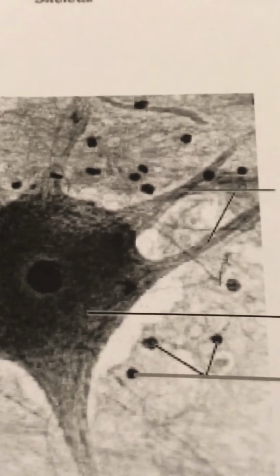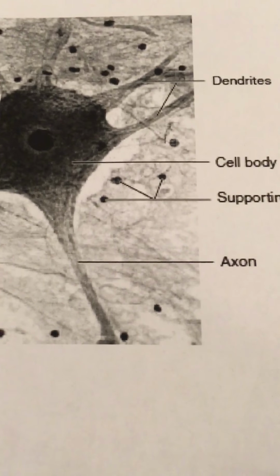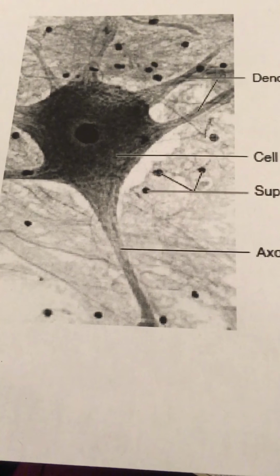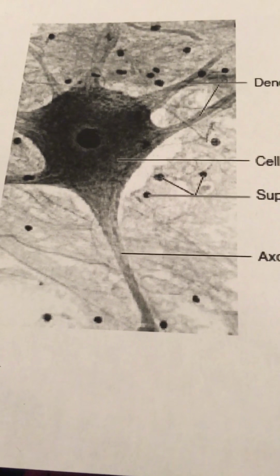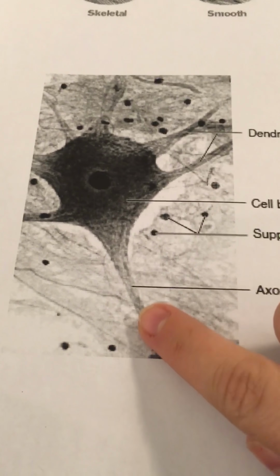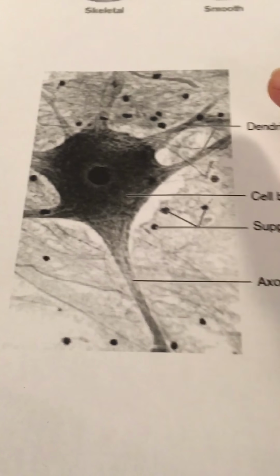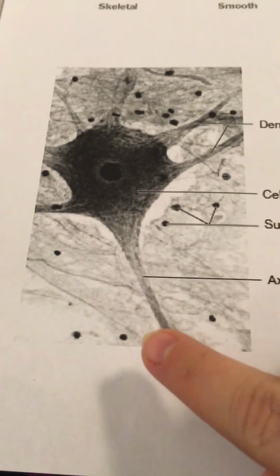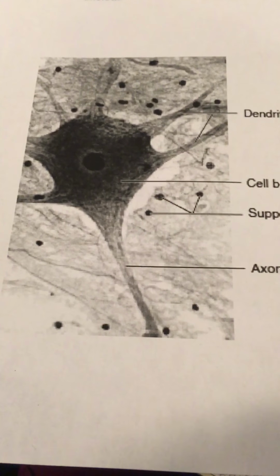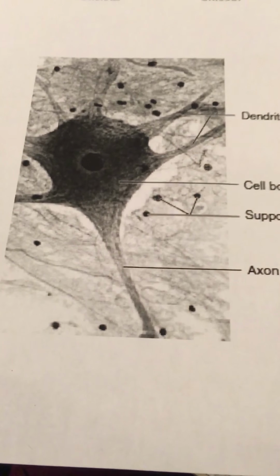So now, our last thing we're going to talk about today is the nervous tissue, and it makes up the central and the peripheral nervous system. And the main function of the nervous tissue is integration and communication. And those are the two main functions. And the main thing to remember about this tissue is that there's the dendrites and the axons. And so the axons will send a message and the dendrites will receive it. So this one will send out a message to another neuron or another cell or another nervous cell, and the dendrites will actually pick up that.